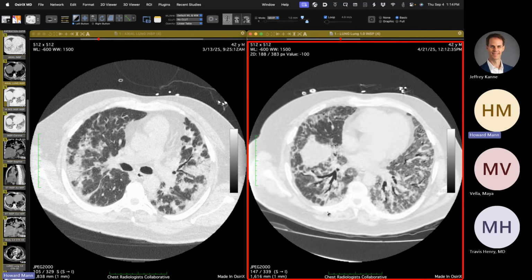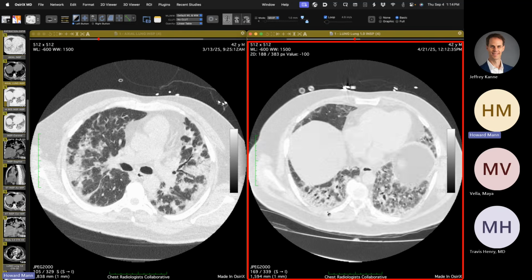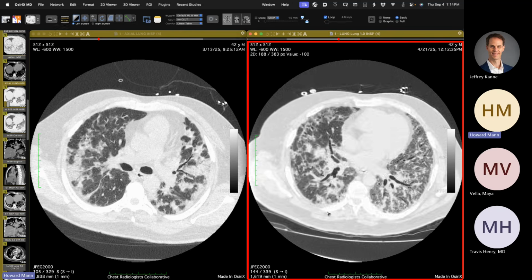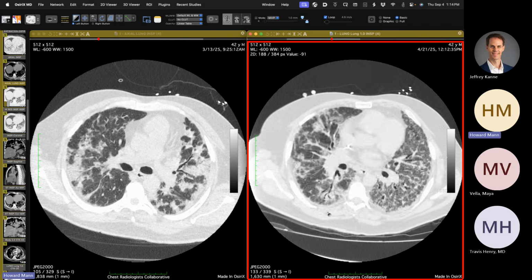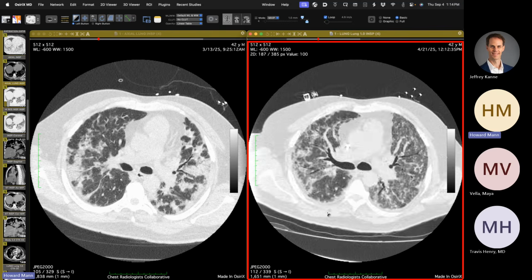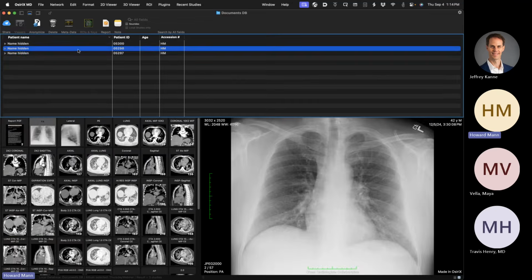Yeah. So a pretty dramatic case of that bad thing, anti-MDA5, which is well described as producing a really bad and rapidly progressive pulmonary disorder. Yeah. Okay, and the last one is just sort of, this is just a bit odd.